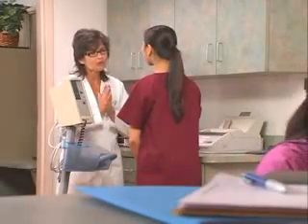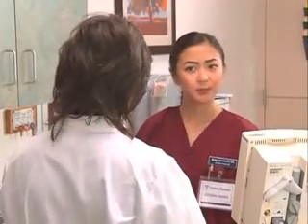All right, Rose, what's going on with your patient? Well, my patient has been having problems with his blood pressure. He has a history of hypertension and his blood pressure readings have been pretty high. He's received a new medication to try to treat it. We need to set up the electronic blood pressure device to measure his blood pressure frequently for the next hour or so. And you have the unit? Yep, right here.